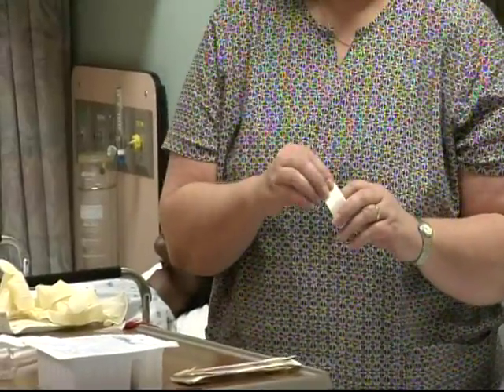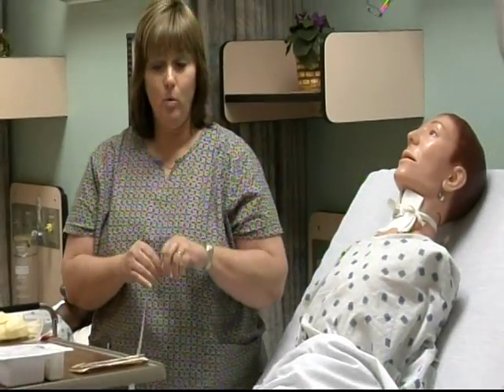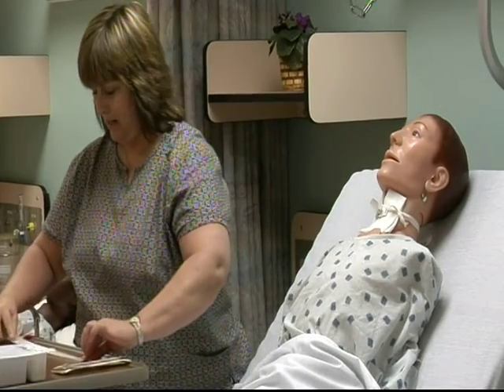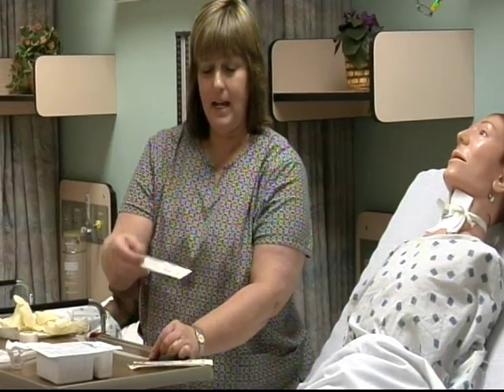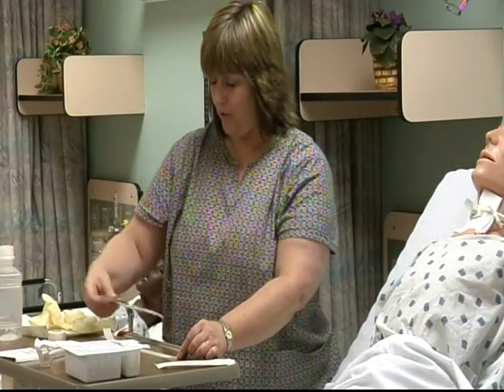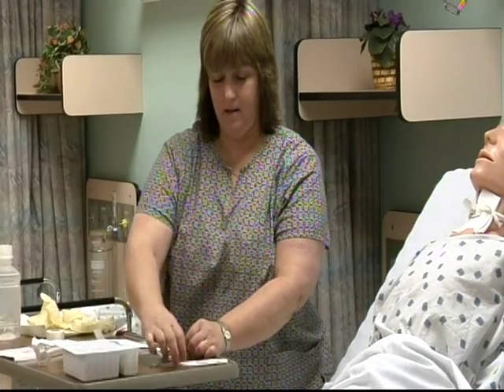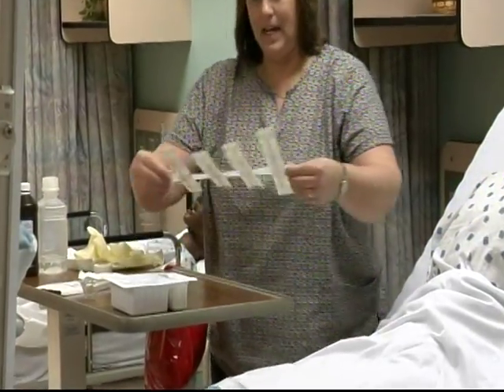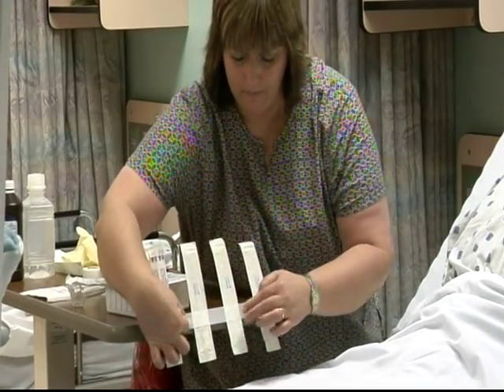The first thing that I have found, nursing has to learn to do procedures on their own and keep it sterile. So what I want you to do is get a piece of long tape, and just kind of place it on your table. Take your Q-tips, place those on the sticky part of your tape, so you can do this procedure right by yourself. Then take this and tape it to your table.